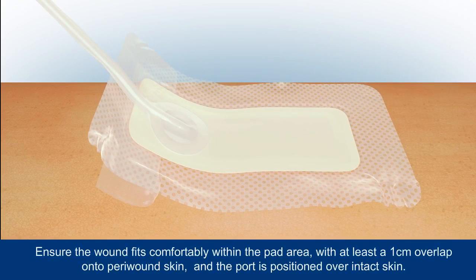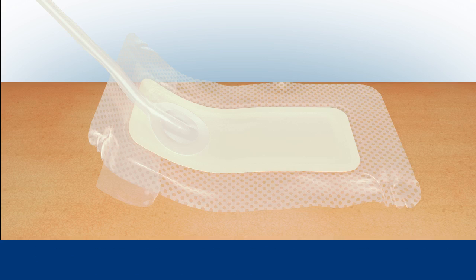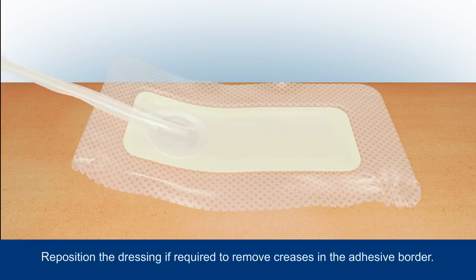It's important that you don't place the port directly over the wound. Remove the remainder of the backing and carefully smooth the dressing borders around the wound, securing it in place.